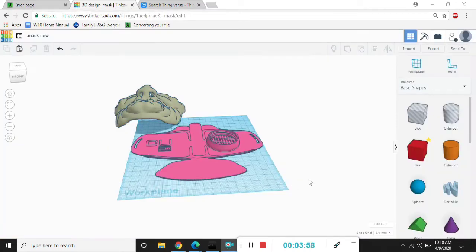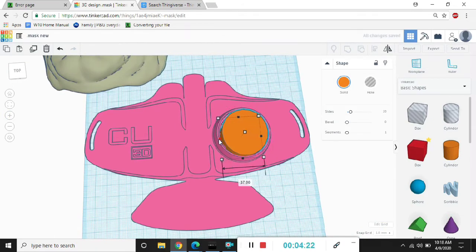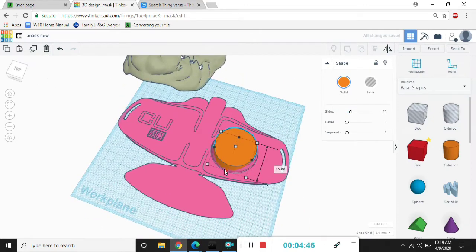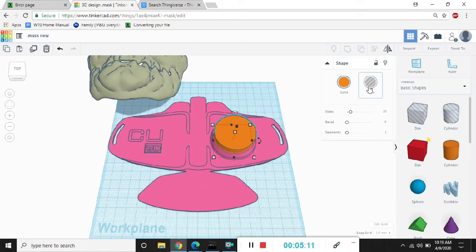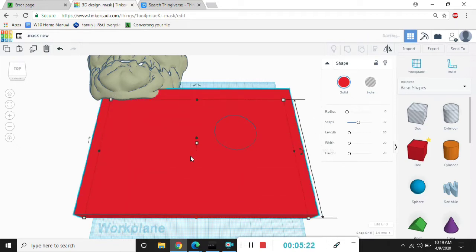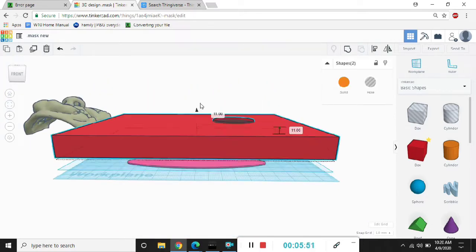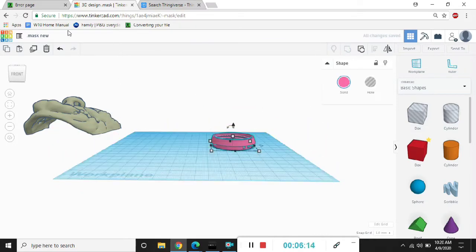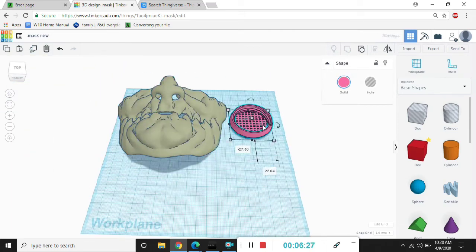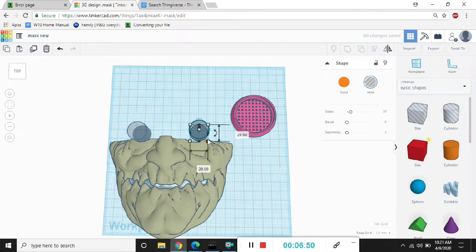Here, I uploaded the N95 face mask. Now I'm putting a cylinder over the N95 respirator and I'm covering all the areas that I want to cut out. Then I'm going to put a cube and stretch it across the whole mask, then make the cylinder clear and group it, put it directly over the mask and group it again. Now I brought the mask back on the grid and I'm just making a couple minor adjustments.